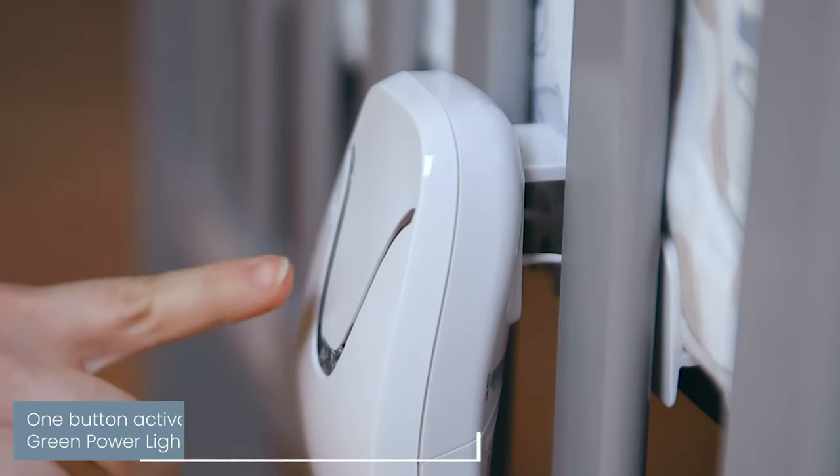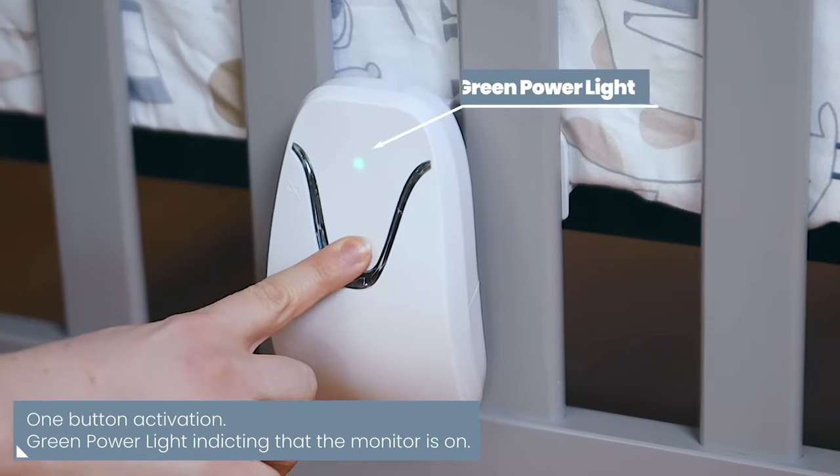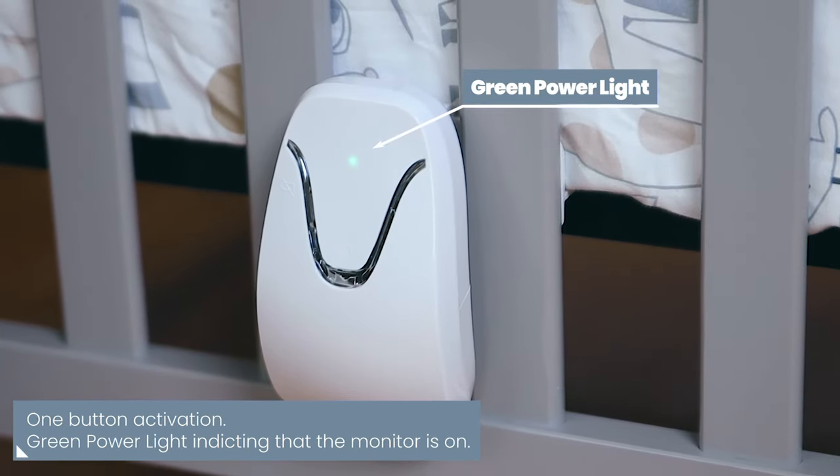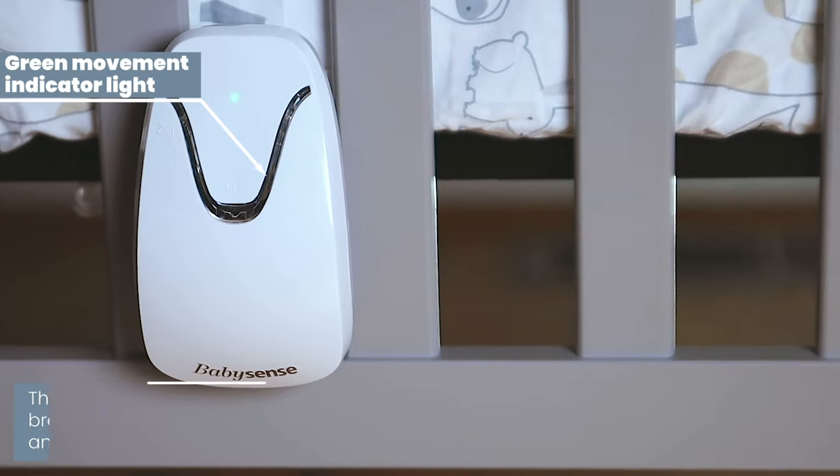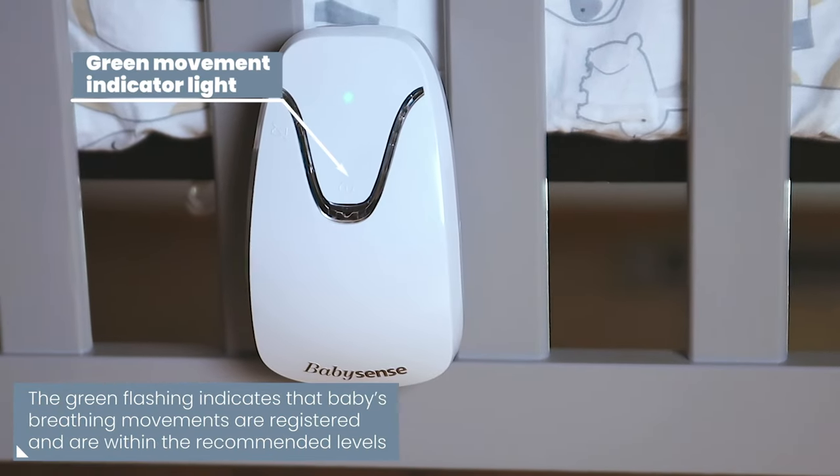Easily activate the monitor by pressing the power button. The green power light indicates that the monitor is turned on, and the green flashing light indicates that your baby's breathing movements are registered and are within the recommended levels.